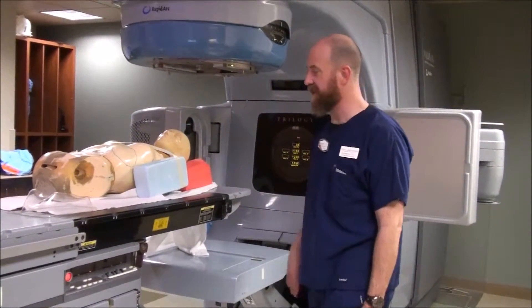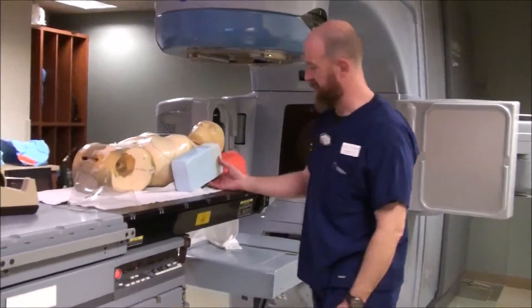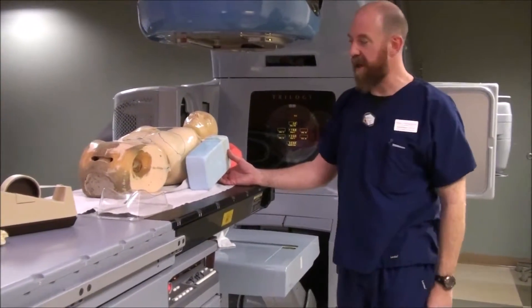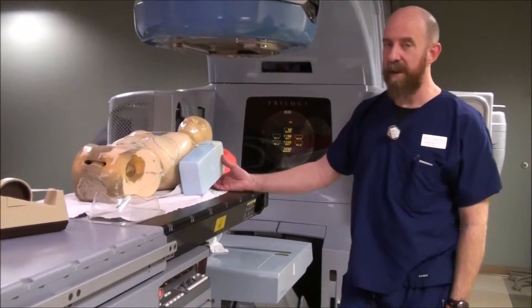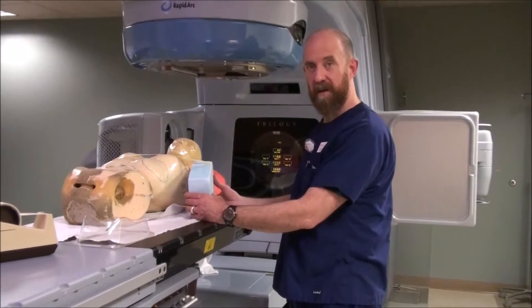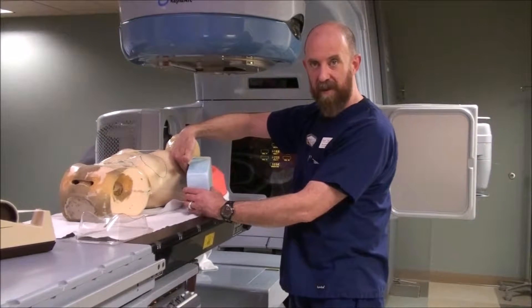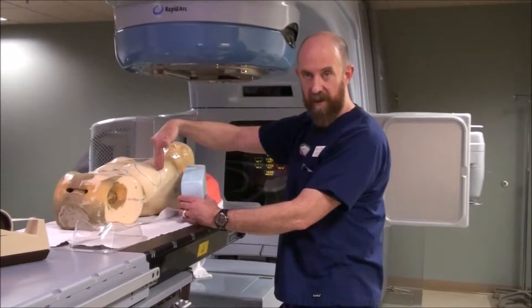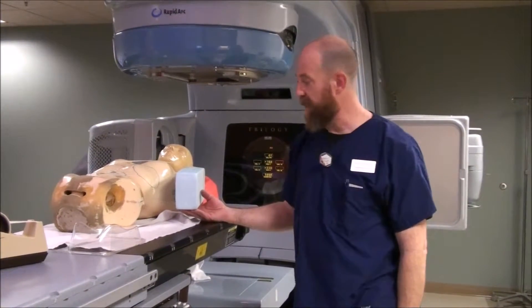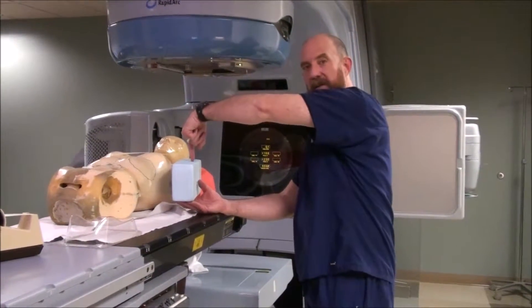You can see that this person has her arm flat up against her chest, and there's a definite slope from superior to inferior. We want to be able to reproducibly make that a little different — we want to kick the arm out away from the chest wall. You're going to open up the axillary area so you have less erythema and less chance of treating through the lung.